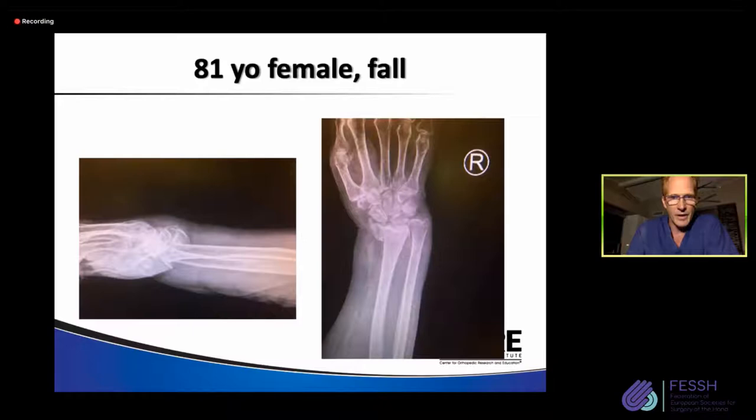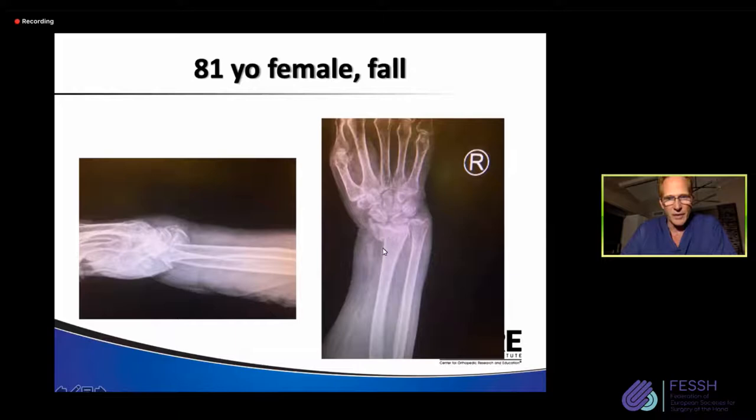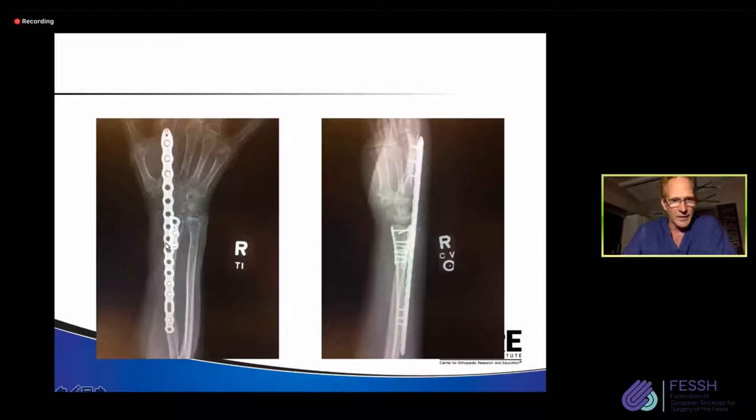Here's an 81-year-old female who fell. Again, we have very soft bone here. We have very distal fragments that are difficult to control, a very comminuted articular surface. Most of my concern was this radial column here, controlling this. And so that's why I decided to span to the second metacarpal. And this helped the problem. I also used some fragment-specific fixation for some other issues.